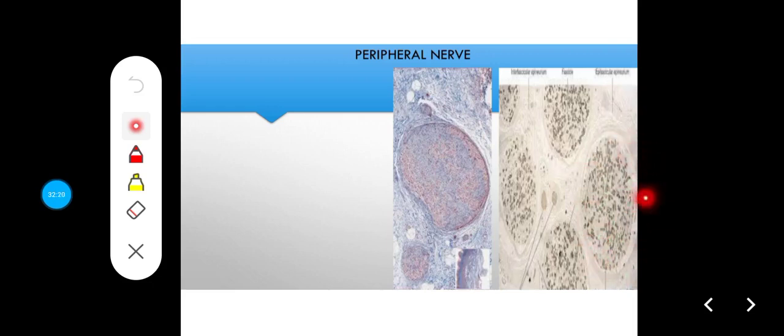So this single bundle is a fascicle, and the fascicle is lined by perineurium. If you bring 1, 2, 3, 4 and bind them together into a single nerve, the covering will now be the epineurium. So that's how the layering is.